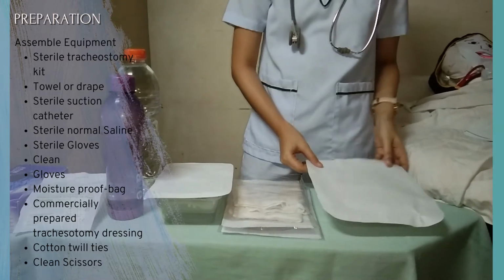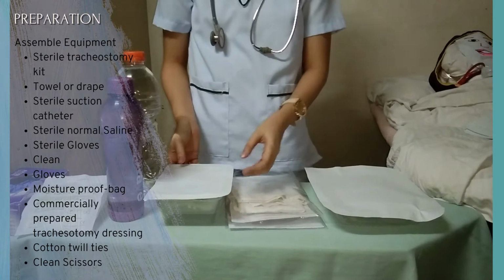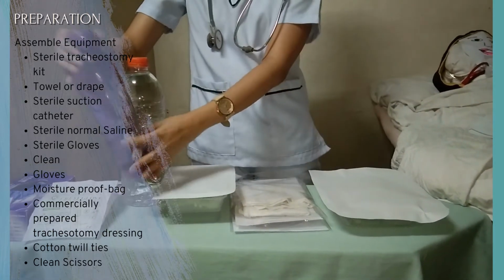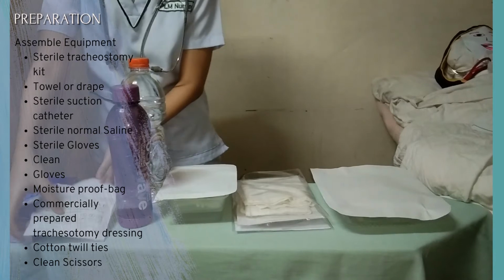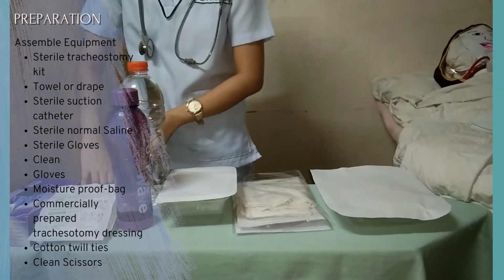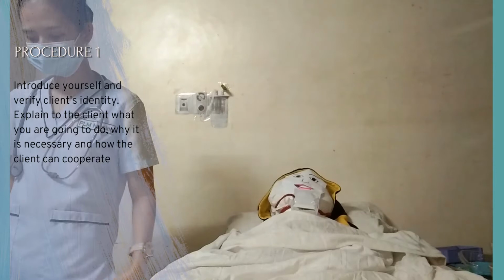Next, we assemble all the equipment including the sterile tracheostomy kit, towel or drape, and sterile suction tubing, sterile suction catheter kit, sterile normal saline and hydrogen peroxide, sterile gloves, clean gloves. You can have a moisture-proof bag and the commercially prepared tracheostomy dressing. Cotton twill ties will be in the tracheostomy kit, and we have clean scissors.